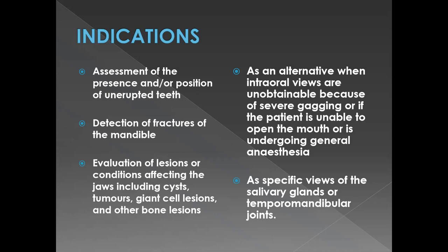However, you can take lateral obliques of the patient while the patient is under general anesthesia, because there is a modification in the technique for taking these x-rays while the patient is lying supine. In fact, the axiolateral techniques, all of which I mentioned to you, you can take when the patient is lying down.